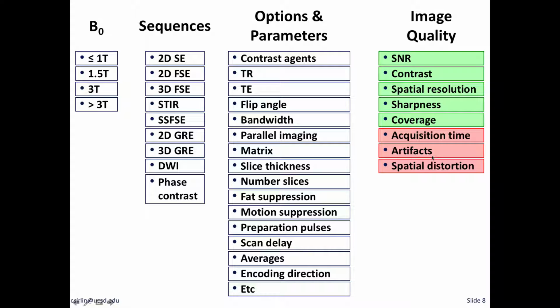Because if something's going to double the true signal-to-noise ratio, then it should also double the spurious signal-to-noise or artifact-to-noise ratio. So just keep in mind that 3T at its best is better than 1.5 T. 3T at its worst is likely to be worse than 1.5 T at its worst. At any rate, this is a very intimidating list of things.